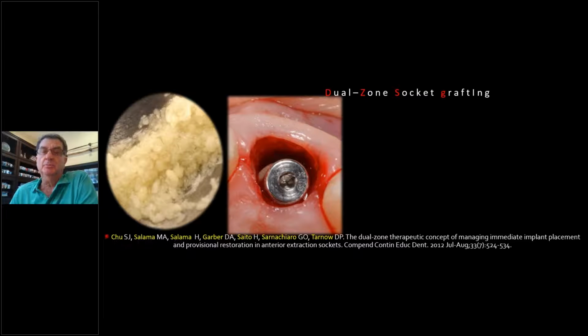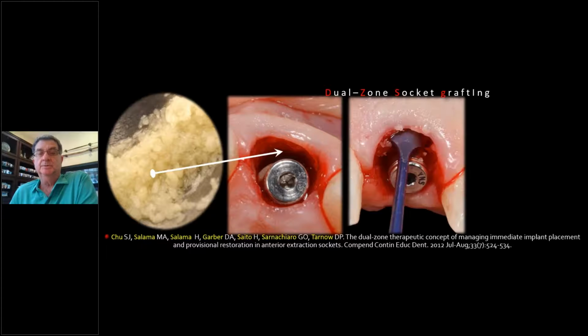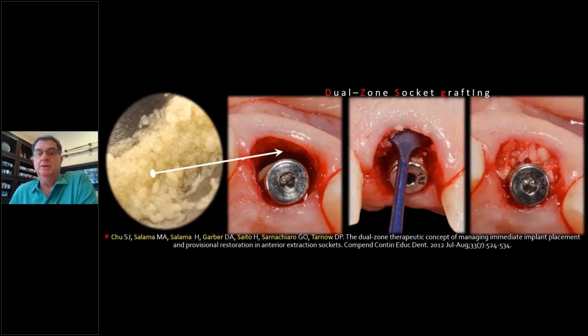And this is why I don't mind the bone chips up to the crest, but we're going to do something called dual zone socket management. So we put the bone chips in, and we have special instruments. Salvin and other companies make packing instruments. And I'm going to put it in and pack it against this here, and then wait till it clots for about 3 to 4 minutes. Then I slowly take off that straight healing abutment.